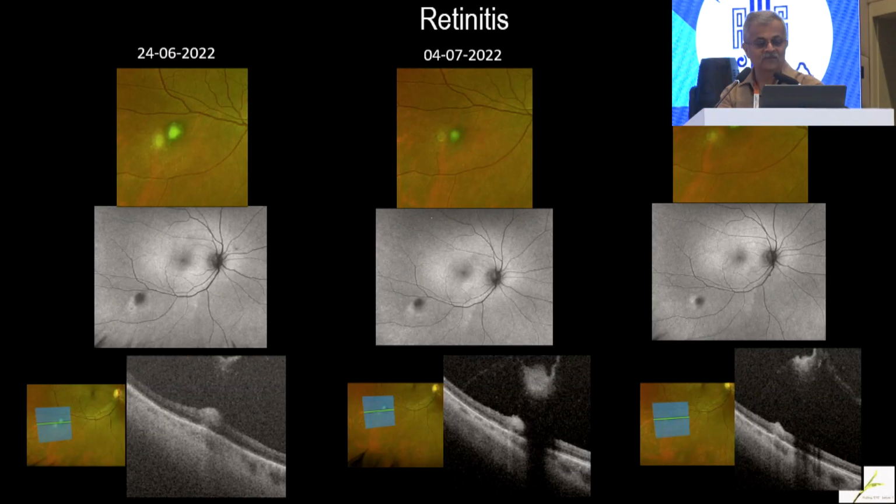This was a case of retinitis. You can see the follow-up very clearly, how the retinitis heals, and you can see the vitreous haze also near the retina. And also, in patients of choroiditis, because it's Swept-source, you can see the choroidal OCT very well.